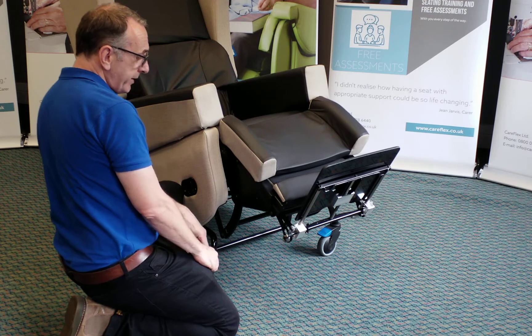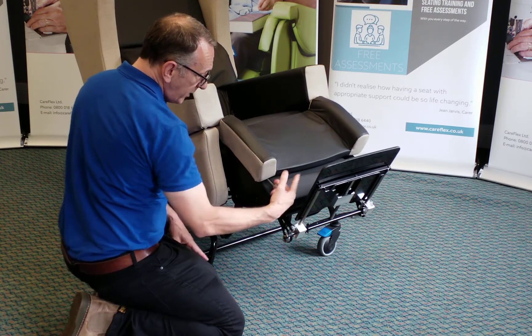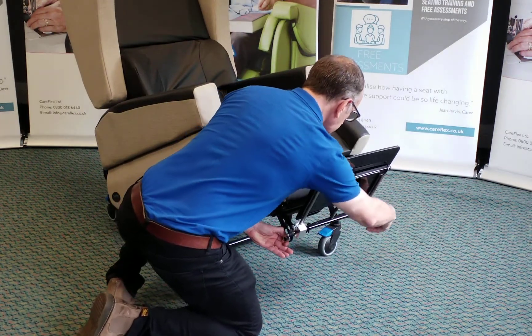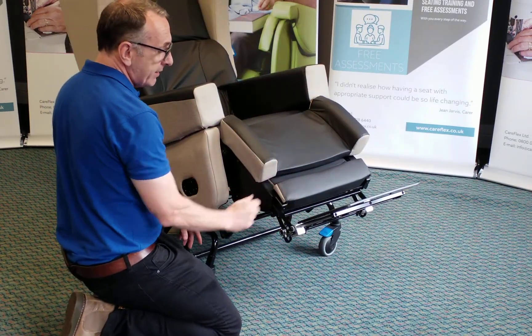The foot plate is also angle adjustable. There's a little wheel on either side of the leg rest. If I pull that wheel out, you'll see I can increase or decrease the angle at the ankle.